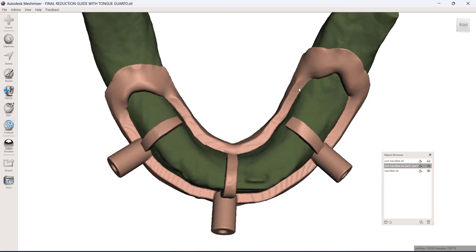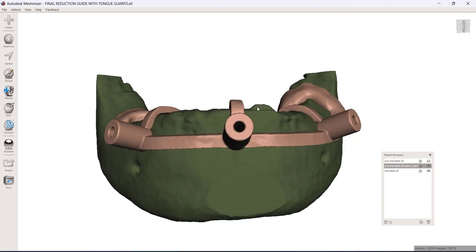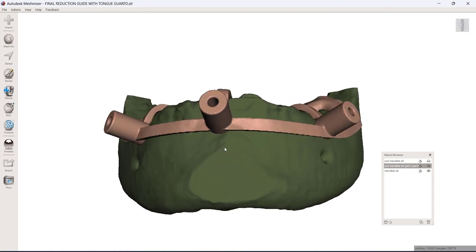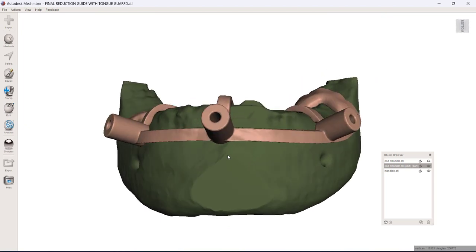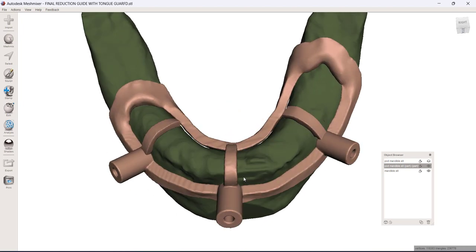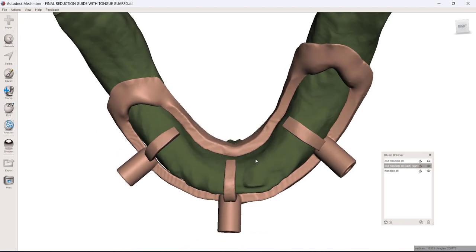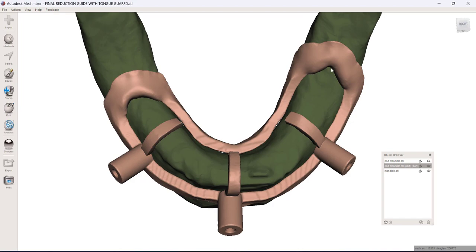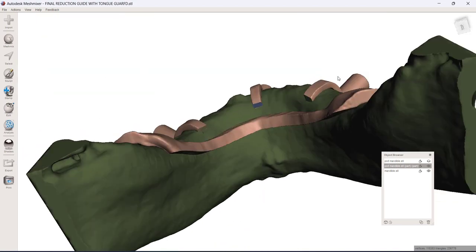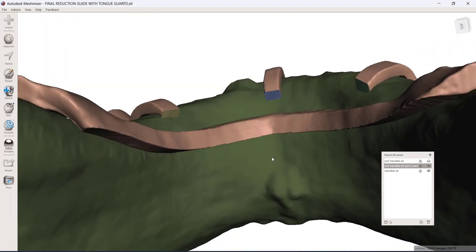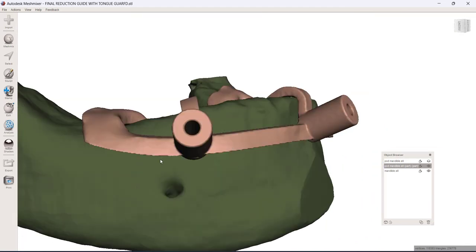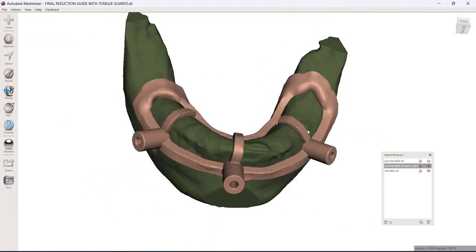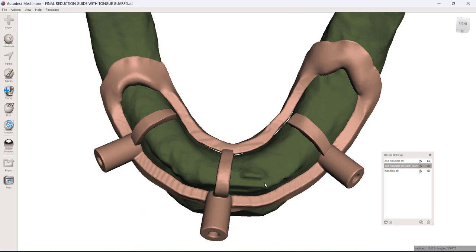Now you'll notice I do have a lingual on this. Sometimes I'll do a lingual on my reduction guides, other times not. If I'm doing them in resin, it tends to help and make a much stiffer overall guide that you don't have to worry about breaking if you incorporate it. So I do have a lingual to this reduction guide.